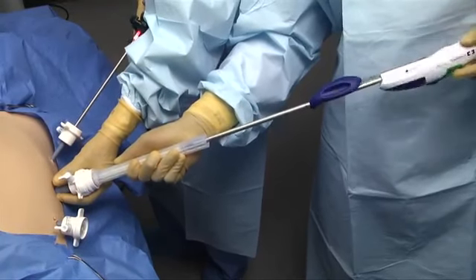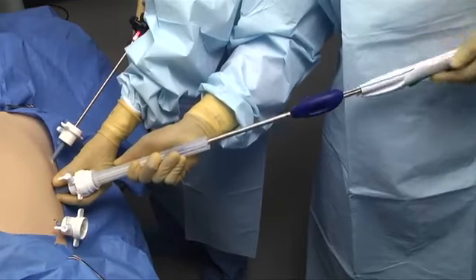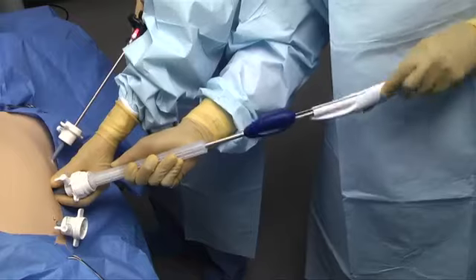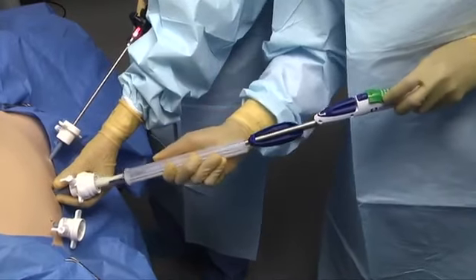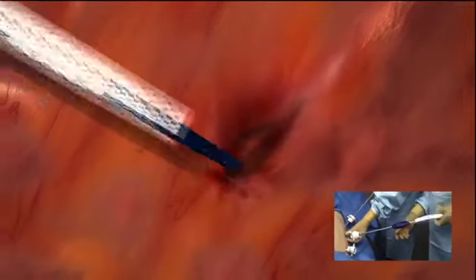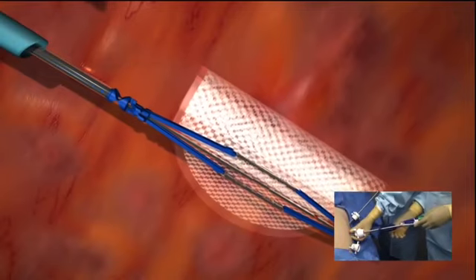Insert the furling tool into the access port. Push and rotate the mesh into the access port. Remove the insertion tool. Push and rotate the mesh into the abdominal cavity under visualization. Deploy the mesh by pulling back on the deployment lever until it stops against the handle body.